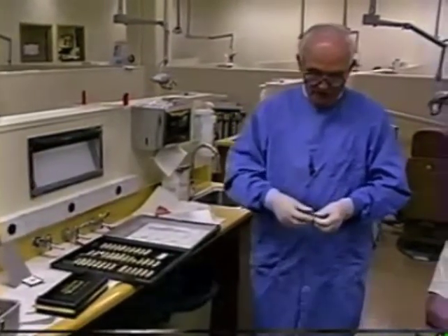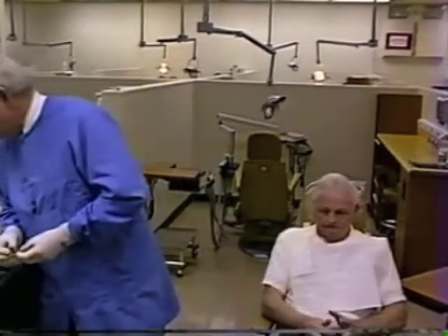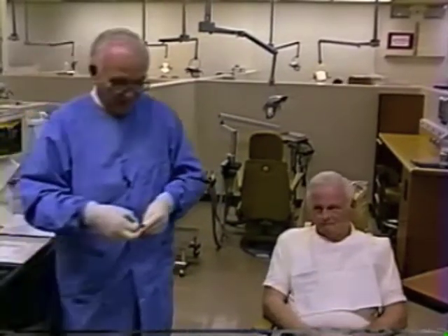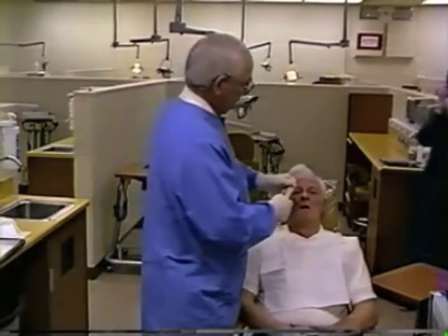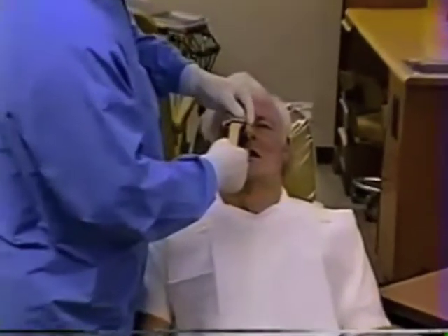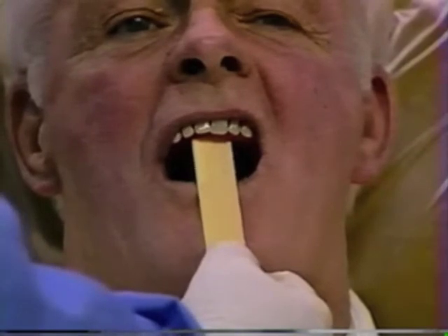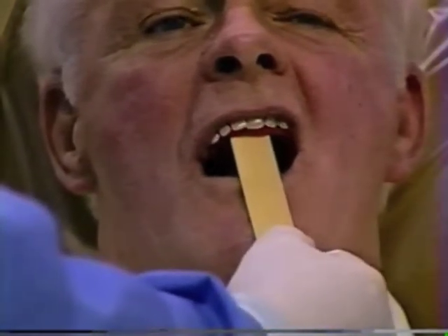We looked at the mold and the square tooth looked better than the tapering tooth. Now let's try a tooth that's too small just to see what it looks like. According to dimensions this tooth is too small. We can tell the difference — the one on the patient's left looks more in keeping with the size of his face than the ones on his right, which appear too small. So we take those off and eliminate that.